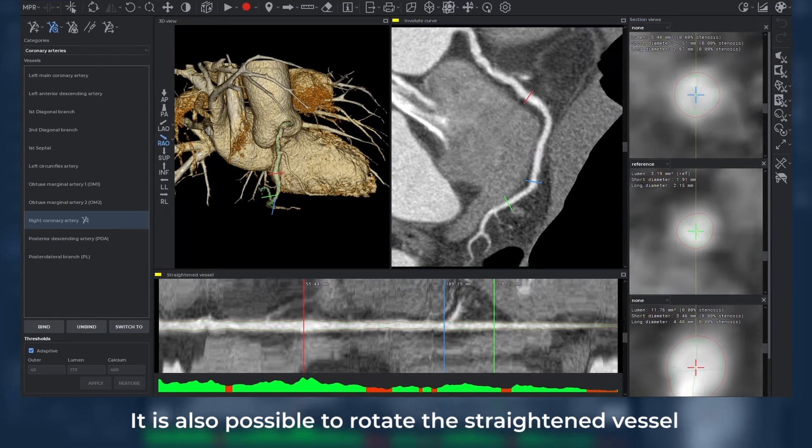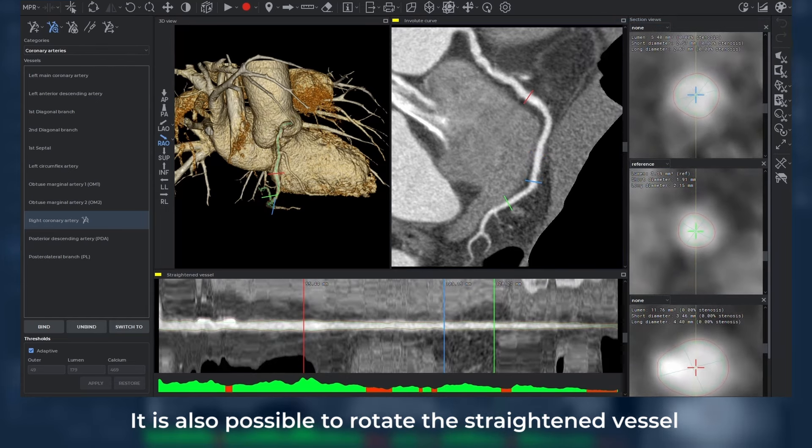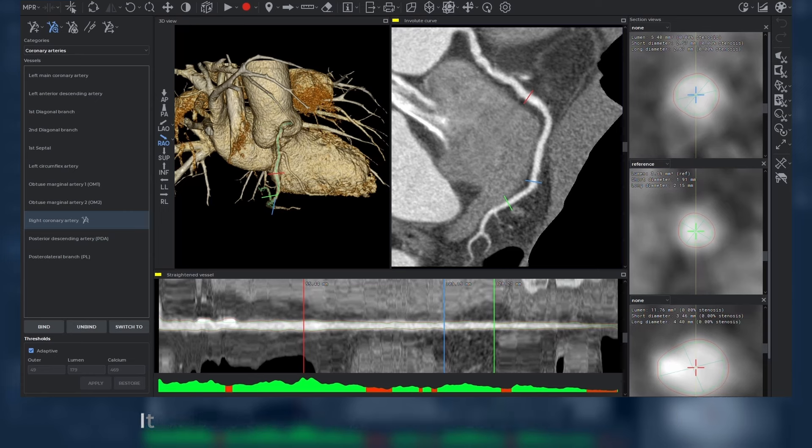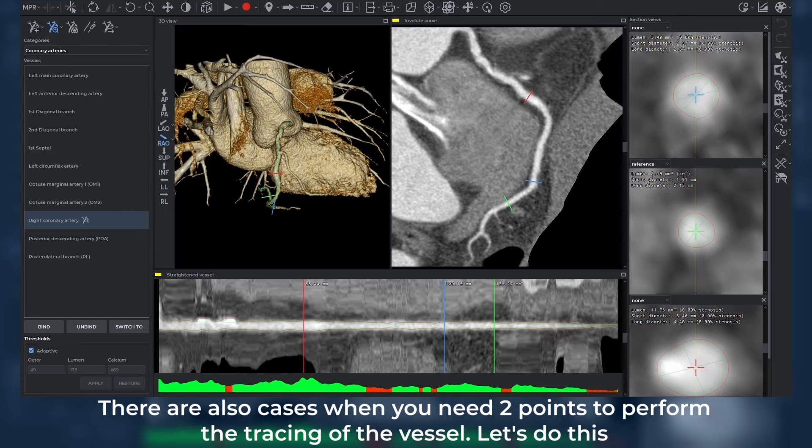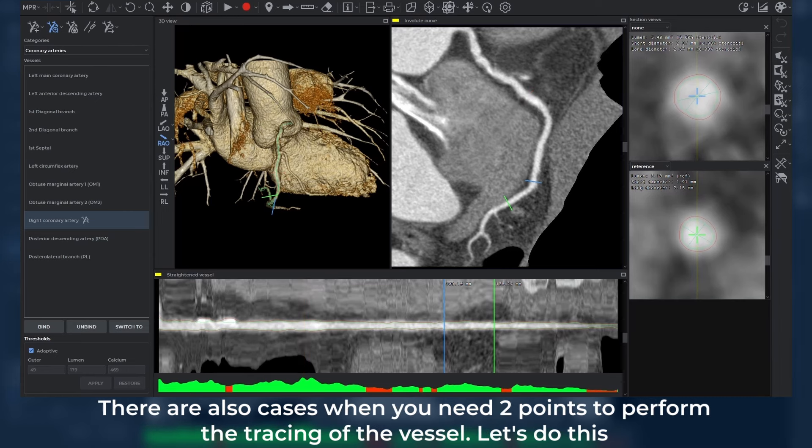It is also possible to rotate the straightened vessel. There are also cases when you need two points to perform the tracing of the vessel.